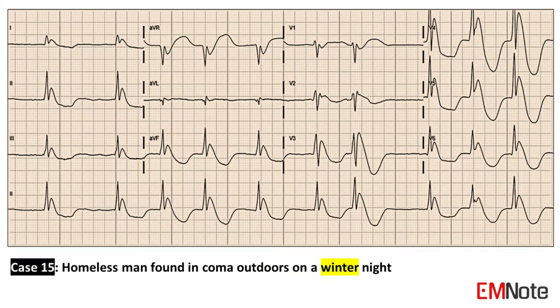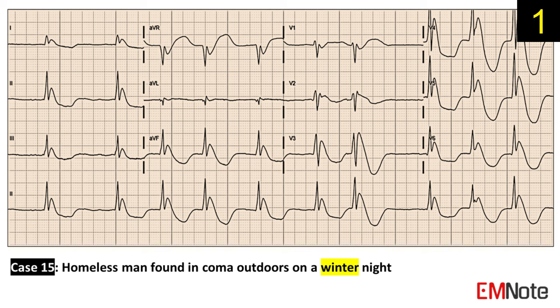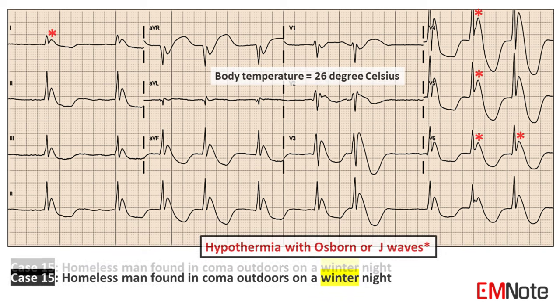Case 15: The patient is a homeless man found in a coma outdoors on a winter night. The ECG shows bradycardia with Osborne waves or J waves. These ECG findings are diagnostic of hypothermia.